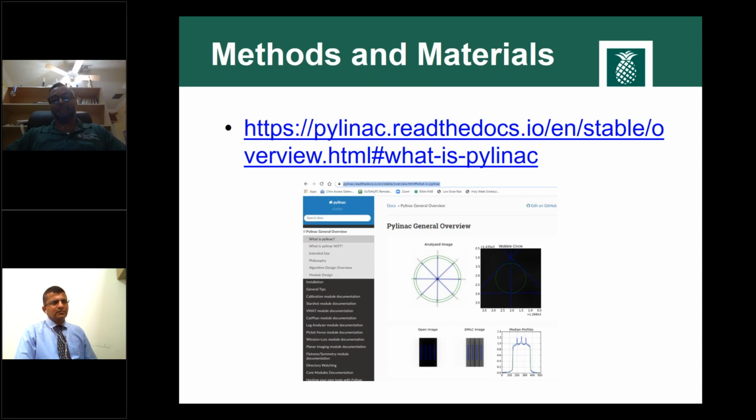But this QA program, as I mentioned, all the people who have done the QA are supposed to present their work to the group. So it is 100% in my opinion. Otherwise, in the worst case scenario, I'm busy with a project like, maybe doing a radiopharmaceutical or an HDR. My team member, as I mentioned, we divided in different teams. So the 3-people team have 3 machines. So my colleague will know what I have done that month. I will just brief him so that he can present my work to the others. So each team is supposed to present their work to the other team and get approval from the group. That's how we organize our QA program and our quality control program.